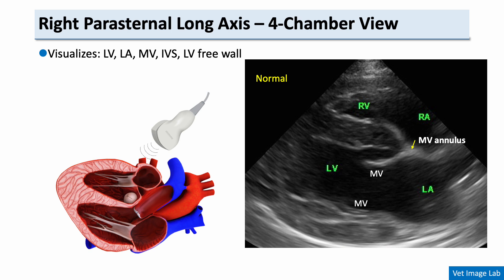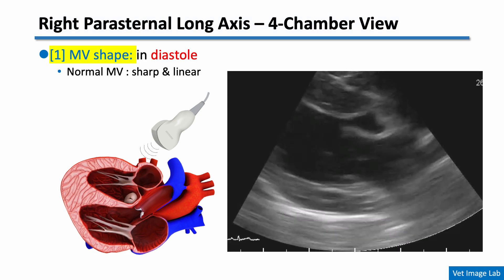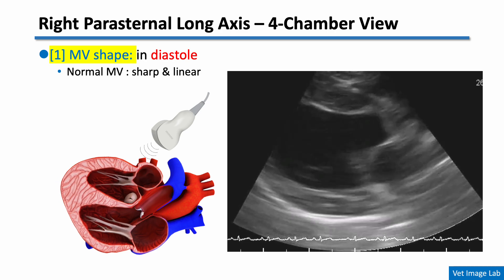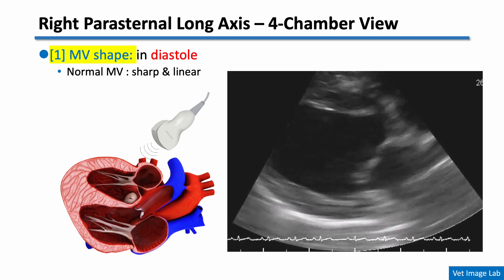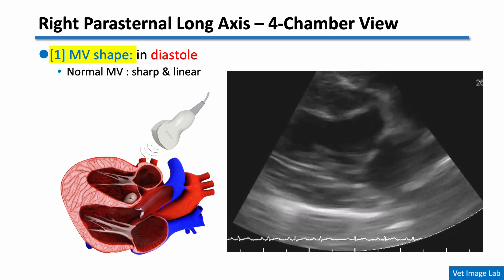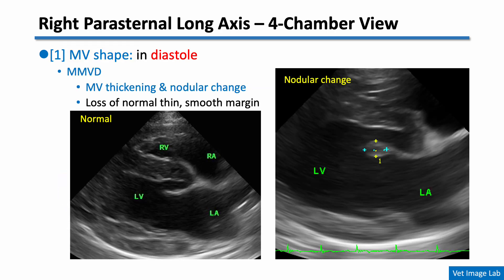Let's start from the right parasternal long axis view. In the four-chamber right parasternal long axis view, we can see the left ventricle, left atrium, mitral valve, and the mitral annulus at the junction between the left atrium and left ventricle. The mitral annulus is a fibrous ring that forms the attachment point for the mitral valve leaflets. The first thing we evaluate is the shape of the mitral valve — it should appear sharp and linear, forming a clear border. This morphologic evaluation must be performed during diastole, when the valve is fully open. In dogs with MMVD, the mitral valve leaflets become thickened and often show nodular irregularities along the leaflet margins, reflecting underlying myxomatous degeneration.